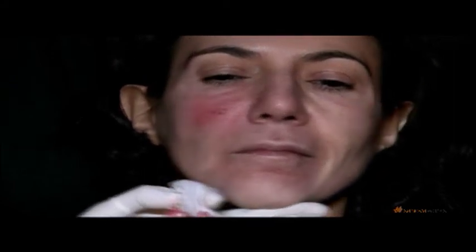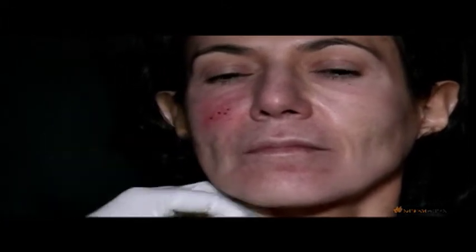Using a high G' filler like the Radiesse, we can reinflate the midface. Faces don't fall, they deflate. We're reinflating the midface, and in doing so, I haven't even injected into the nasolabial fold, and I've already elevated it quite a lot. These days, the nasolabial fold is actually the last area that I proceed to.